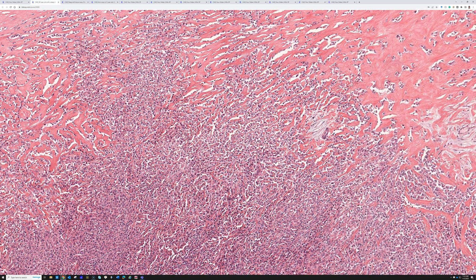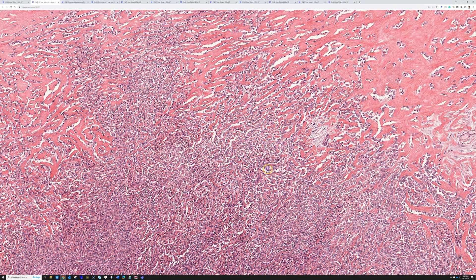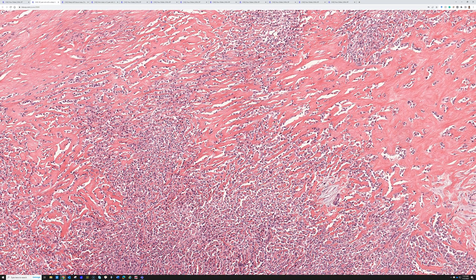When you recognize that pattern, you can do an immunostain to help prove the diagnosis. The answer is MUC4 — M-U-C-4. MUC4 is the stain that is positive in low-grade fibromyxoid sarcoma, and it's also positive in this entity.